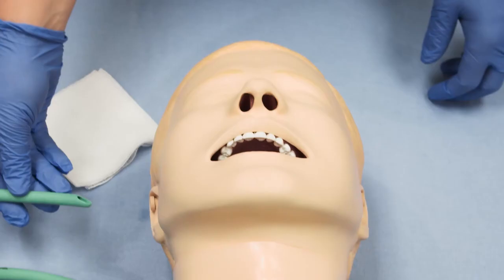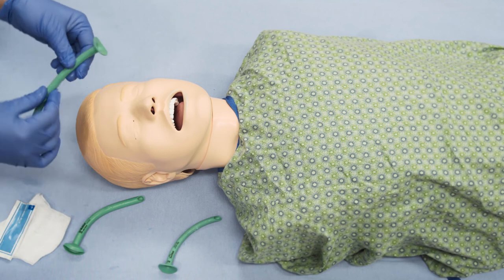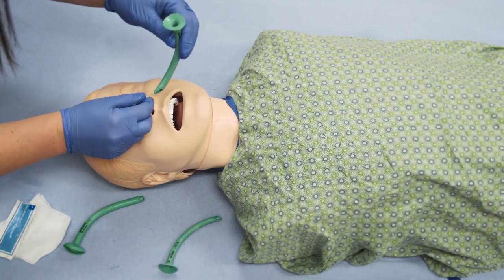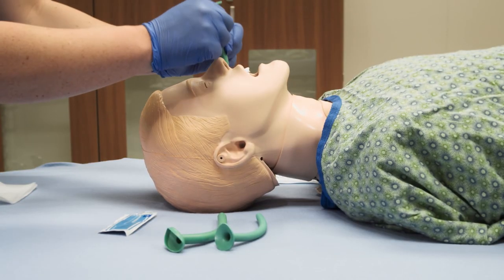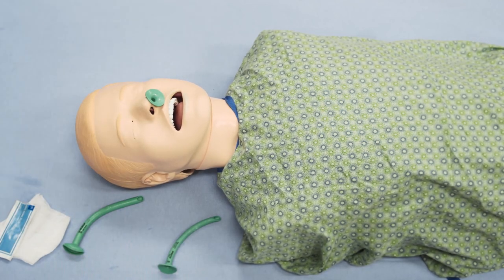Assess the nasal passage for any obvious airway obstruction. Lubricate the NPA well and insert it into the nostril, directing it along the floor of the nose posteriorly towards the throat until the wide, flat portion of the tube rests against the nostril.